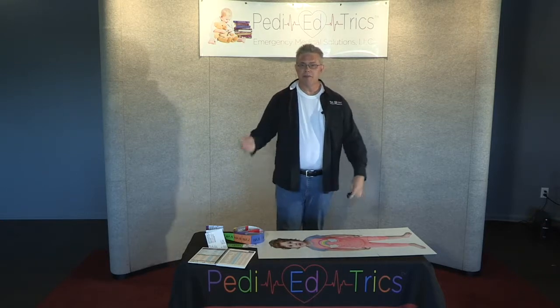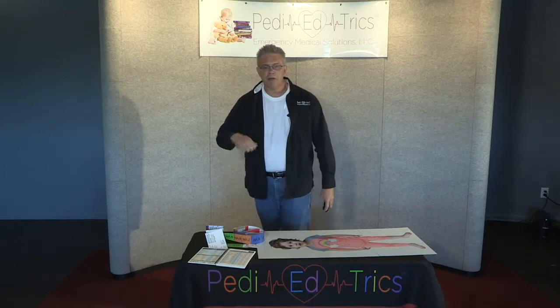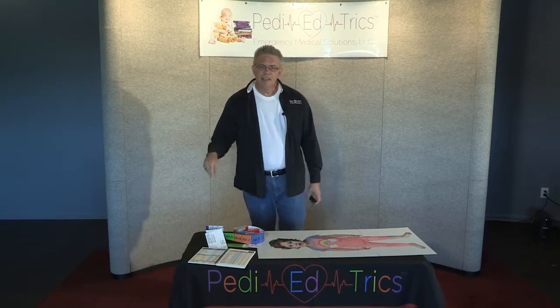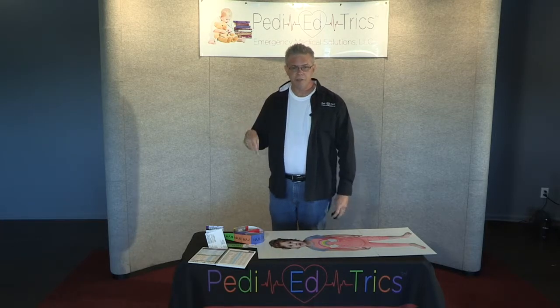So now the problem is this kid's intubated. We've got to suck out the boogers. And why that's an issue is you open your crash cart in the ER and you're going to find 5, 6, 8, 10, 12, 14, 16, 18 French. So which one actually fits down a little kid's tube is called 2 times the size of the tube.